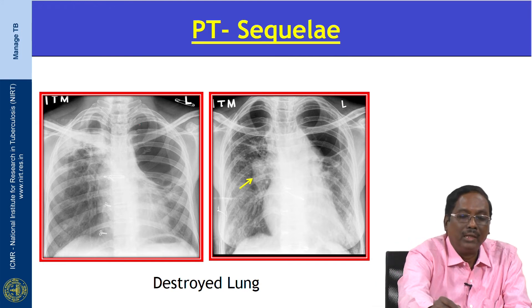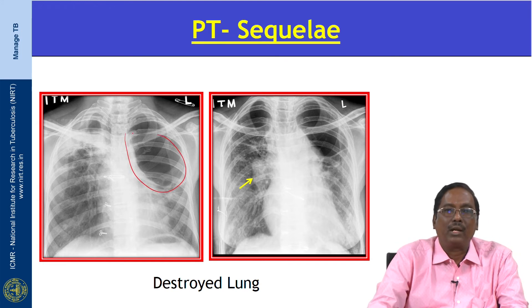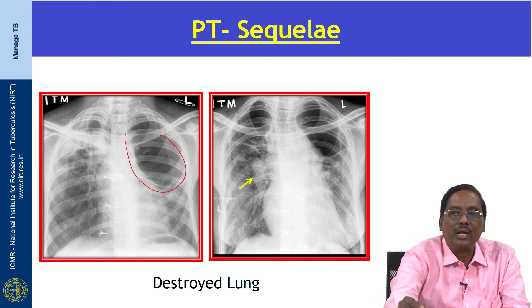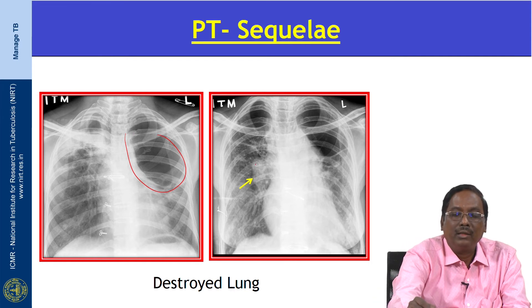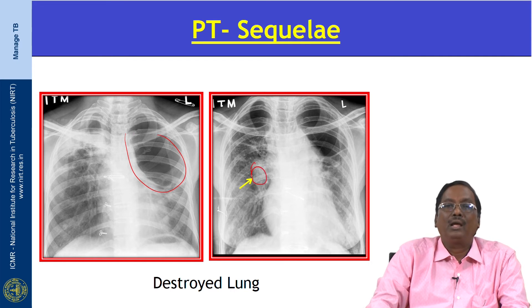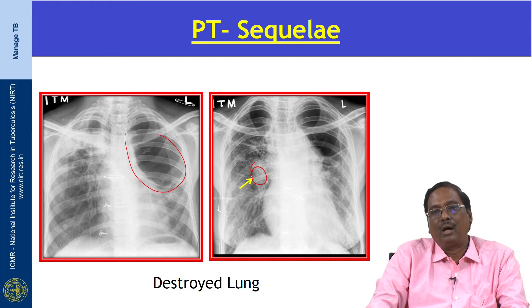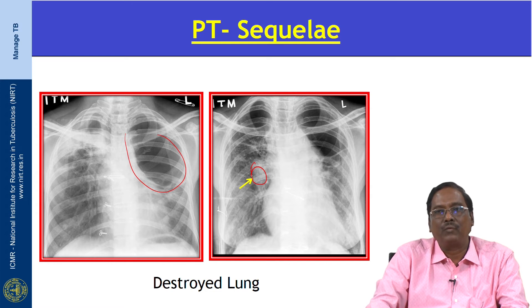This x-ray shows a large cavity — it is a destroyed lung. There is hilar enlargement, which represents a dilated pulmonary artery as a sequelae of TB, as the patient is developing cor pulmonale.